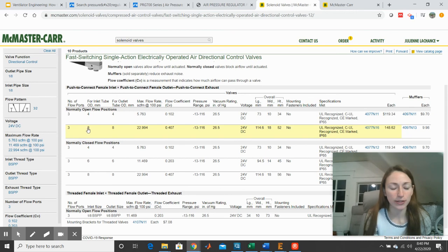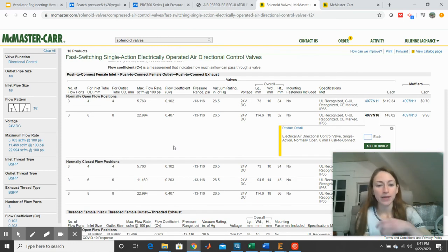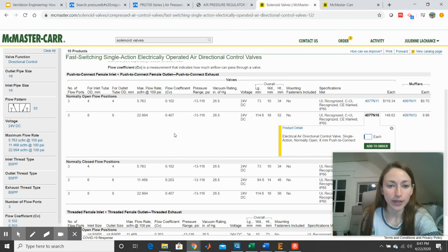And I'm going to look at these inlet and outlet tube diameters. I prefer these 8mm ones because that fits my standard pneumatic tubing size. And then I'm going to look at the rest of these parameters here. So they give a flow rate specification, they give a flow coefficient, which is pretty small. We have to think about whether this is large enough to flow for our specific application. That's one benefit of getting away with process valves if you can. But we're going to think about whether this is too restrictive for our application. I check the pressure range to ensure that I'm not limited here, that the valve will still actuate to some degree and I'm not exceeding any of these bounds in any way.